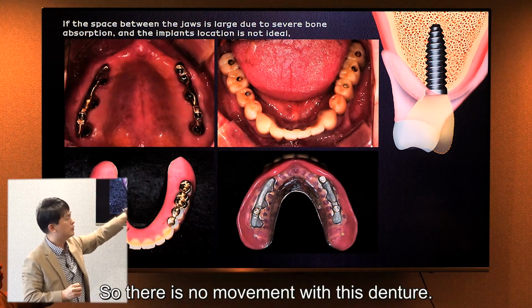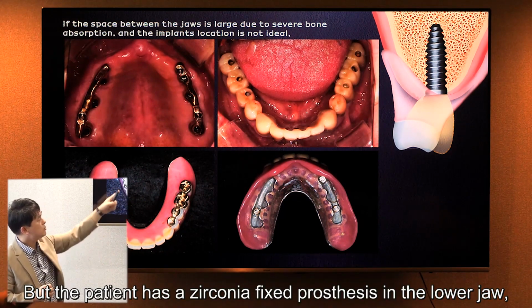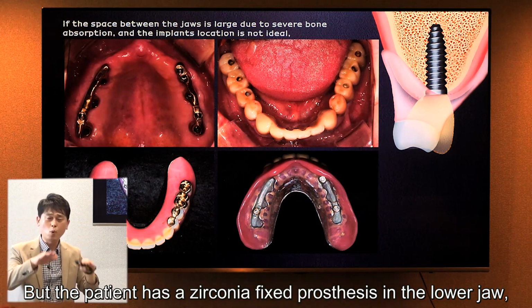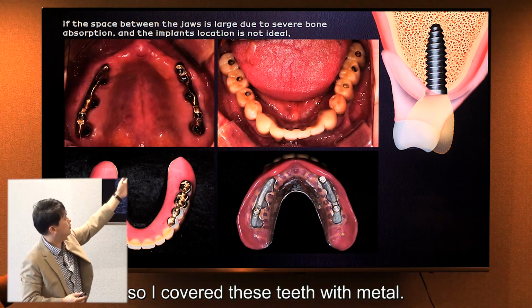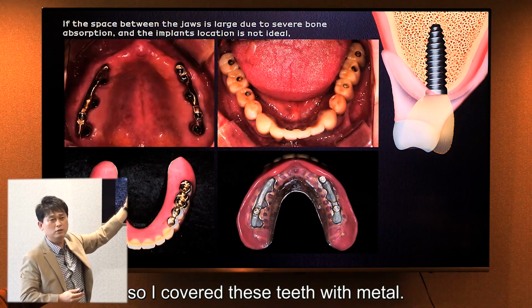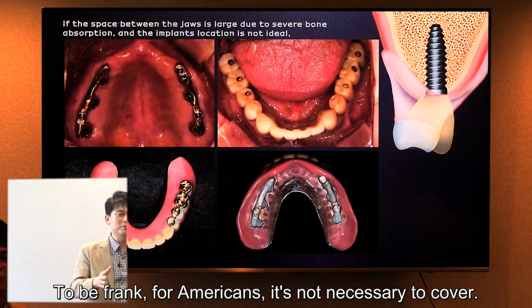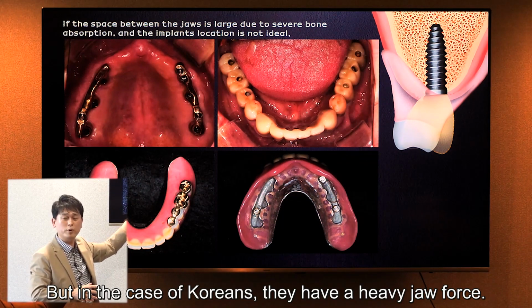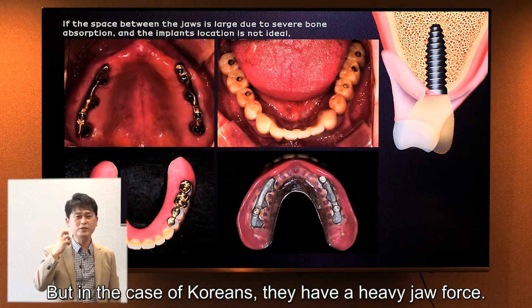So there is no movement in this denture, but the patient has this zirconia fixed prosthesis in the lower jaw. So I covered these teeth with metal. But to be frank, in American people, it's not necessary to cover. But in the case of Koreans, they have heavy jaw function, heavy force.